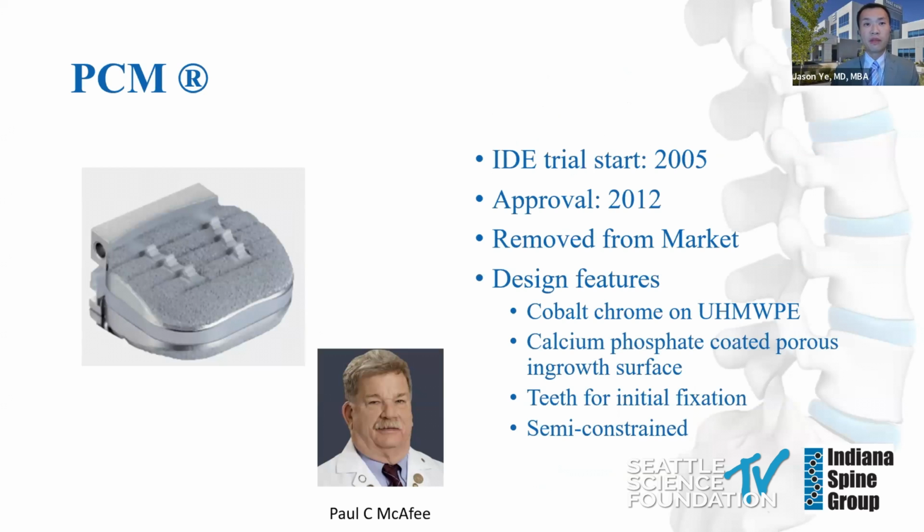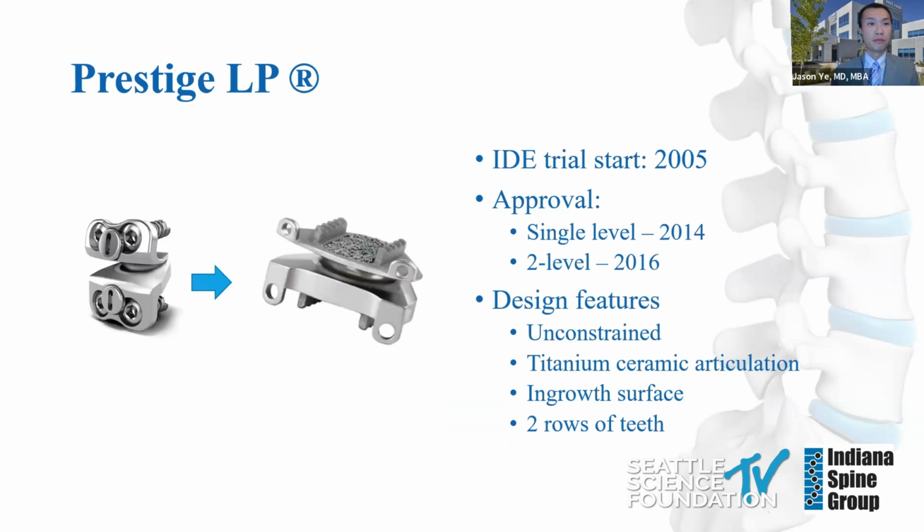In 2005, the PCM disc started trials and was ultimately approved in 2012. The device used a cobalt chrome on polyethylene bearing surface. This disc was different from the previously approved designs in that small teeth were used to achieve initial fixation. This may lead to less bone loss in case of future removal. Ultimately, it was removed from the market, reportedly for business reasons.